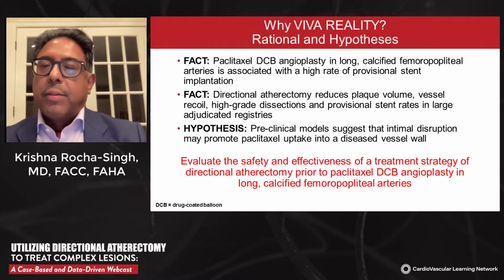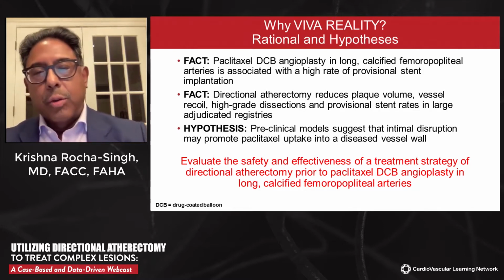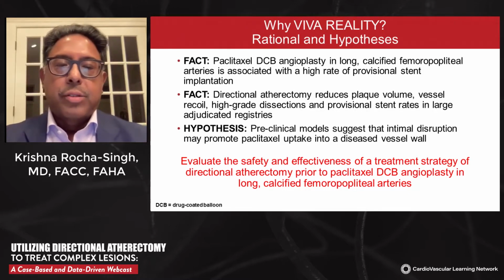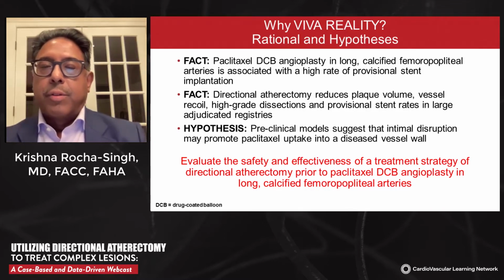We know from the DEFINITIVE LE trial, a large adjudicated registry, that directional atherectomy is also associated with reduction in plaque volume, reduction in vessel recoil, can reduce high-grade dissections, and potentially reduce the rate of provisional stenting.